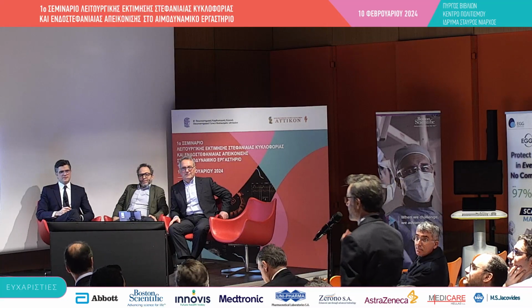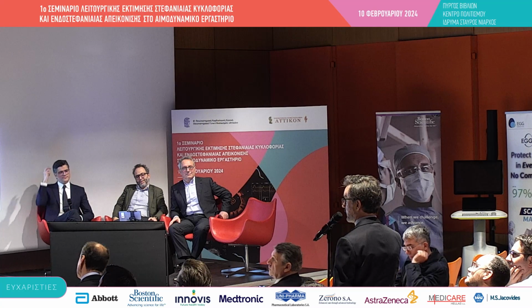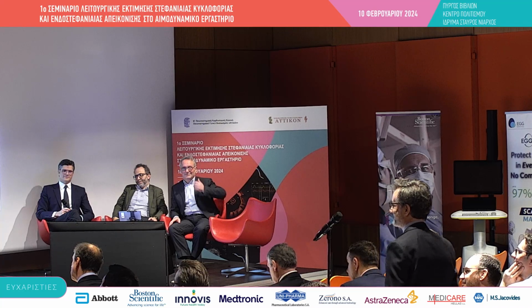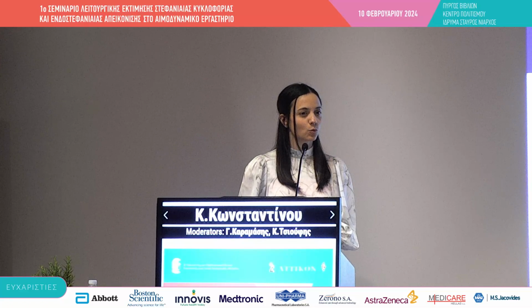Thank you for this beautiful talk. I just have a question. What do you feel about manipulating the artery before testing for spasm with a wire that can be irritative in itself? Yeah, thanks for the question. A difficult one. I'm noticing that most of the patients don't have normal coronary arteries, normal LADs. There's often tortuosity. There's often diffuse mild disease. I've not noticed significant spasm after passing the wire down. We've not had that yet.